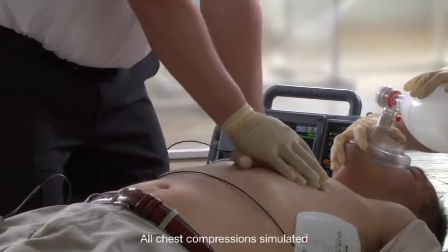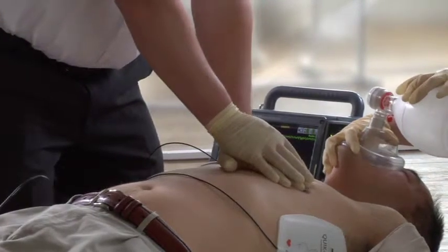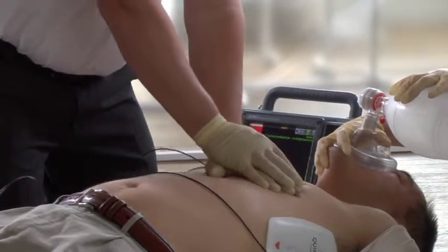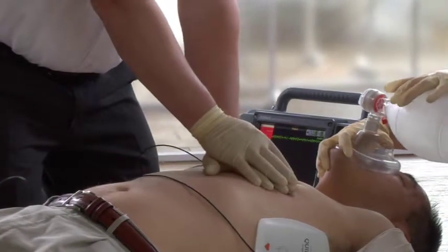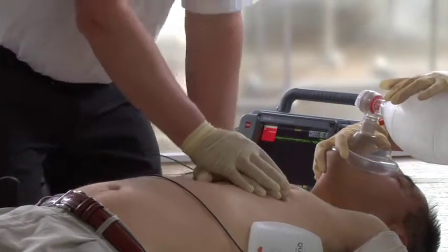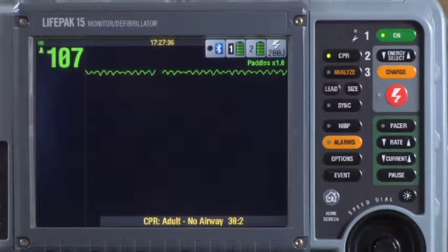The metronome gives you tones to time compressions and prompts for ventilation. 3, 2, 1. Ventilate. At the end of your CPR period, stop CPR briefly and assess the patient's rhythm. Repeat the shock sequence if necessary.